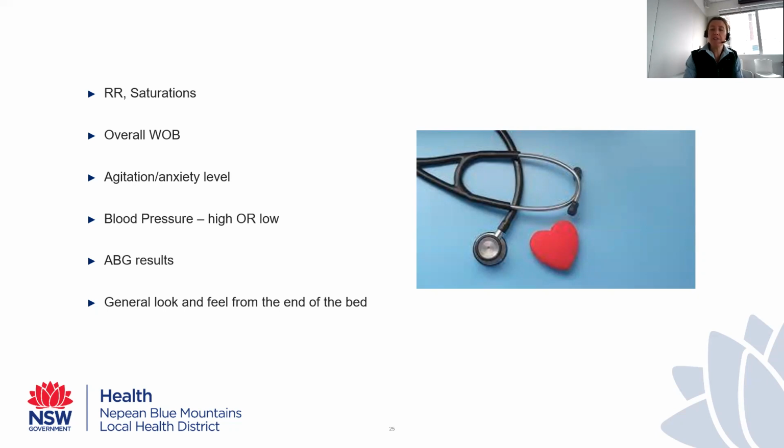So that's why I say never discount if someone looks anxious or is telling you that they feel anxious. You need to take that into consideration in your physical assessment. It's the same as agitation. Patients who can't breathe get agitated. It's a panicky feeling. They can't get enough air in, they can't get air out, and it really triggers that fight or flight response in us, right? So don't disregard those signs and symptoms.